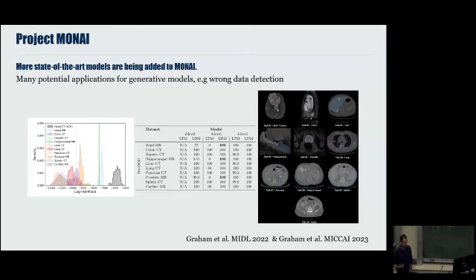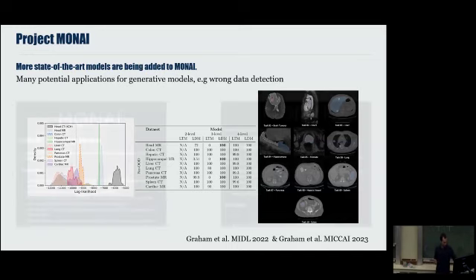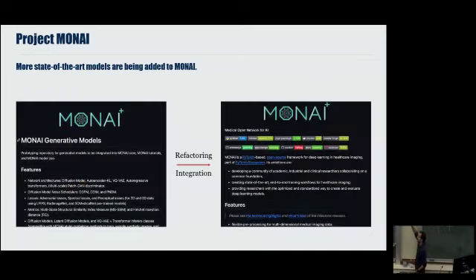And then we are able to, with very high accuracy in their testing sets, actually classify all of these images as outlier or as the expected data type successfully. So these generative models are pushing it, and all that being used to generate all of the results that I showed you is in a repository called MONAI Generative.